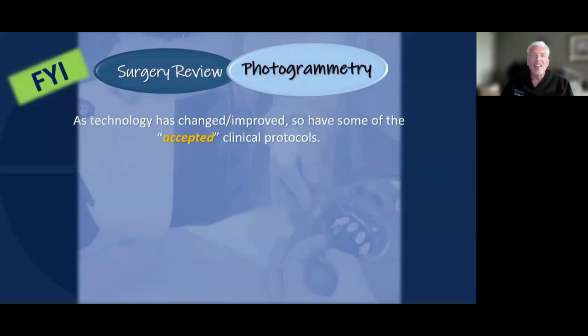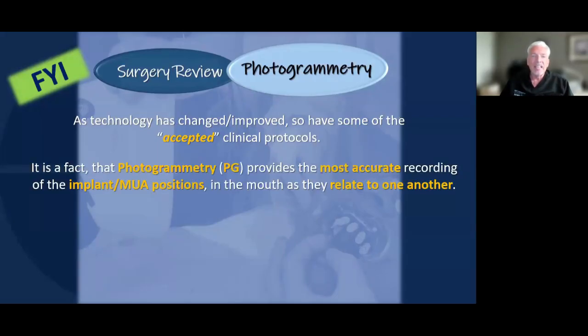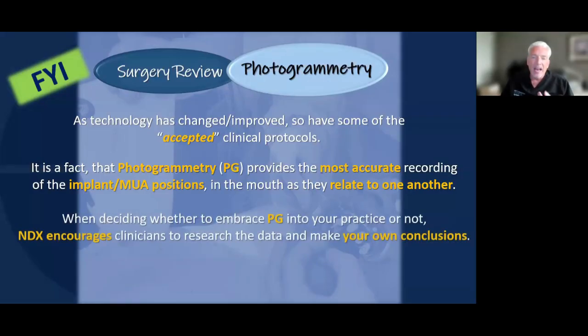Along the lines of what I was just saying, we have seen changes, and we're able to accept some different protocols that maybe we didn't think were acceptable 6 months ago or a year ago. And like I said, photogrammetry is the most accurate way of doing it. I think you need to make your decisions about whether you need to embrace this technology into your practice.